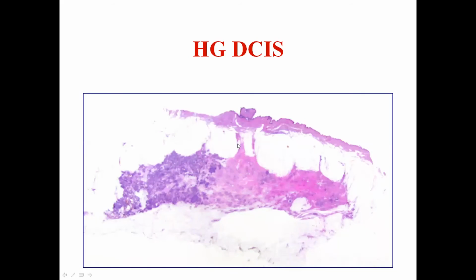This is another example. You see, this was a mastectomy because this is a very large tumor area. In this case, it was not possible. Our surgeons and the radiologists decided that it was not possible to take away just half the breast. It was not suitable for reconstruction.